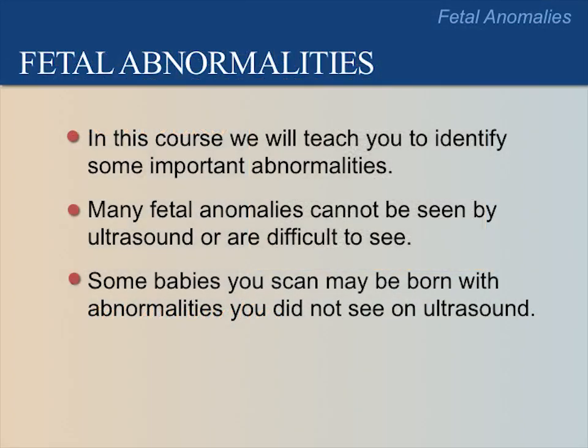In this course, we will teach you how to identify some important abnormalities. Many abnormalities cannot be seen by ultrasound or are difficult to see. Therefore, we do not expect you to identify all abnormalities on ultrasound. Some babies you scan may be born with abnormalities that you did not see on ultrasound. This does not mean you made a mistake. We are also not able to teach you in this course how to identify all fetal abnormalities.